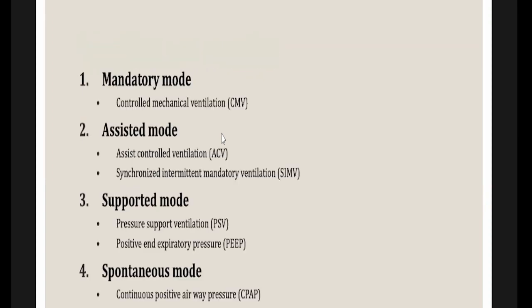Then let's discuss the ventilatory modes, right? Okay, so there are a couple of ventilatory modes. So this is the simplest way that I could describe it to y'all. I'm not going to complicate the picture. So you have a thing called mandatory mode. So in the mandatory mode, the patient is helpless. He will have to take whatever we give from the ventilator. That is the idea of mandatory mode.